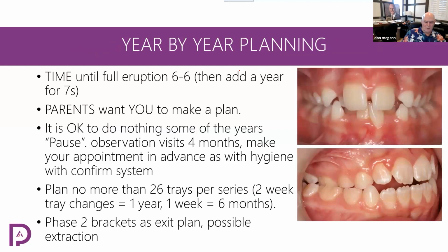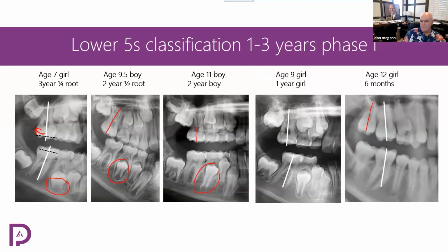All right. So, can you do this with a bracket? Yes, you can do that with a band. On our Roth bracket, we have a 10-degree distal offset on the upper molars. That means that takes out that molar rotation. And then we can also use a non-extraction number 1 arch wire that adds to that rotation correction. And then we can do a tip distal weld on that upper one, and we can tilt that back. But that's only like 3 degrees or something. That's not so severe. On an aligner, you just say distal rotate, distal crown torque, and then you look at your tooth movement table.